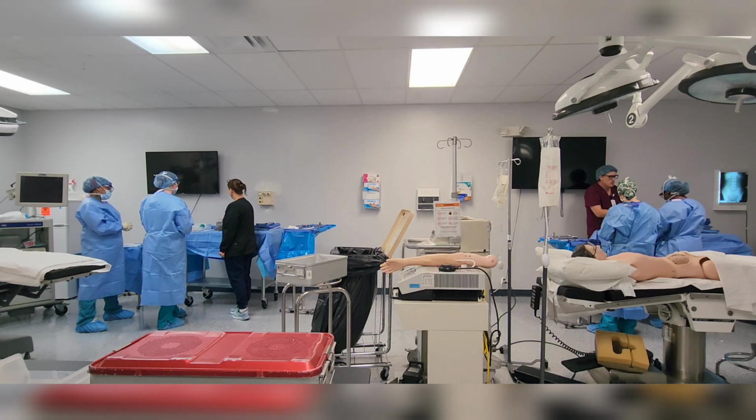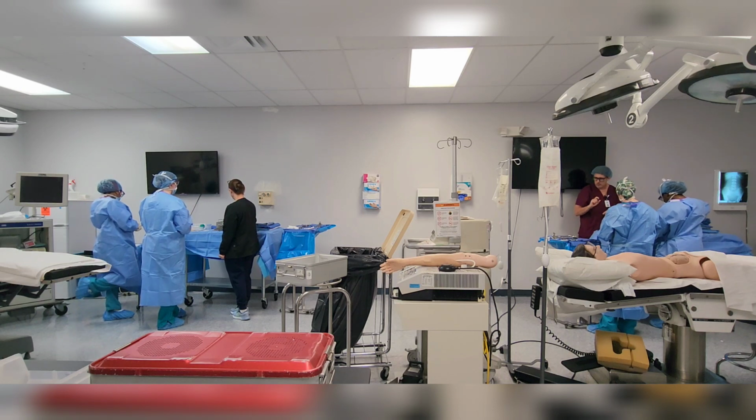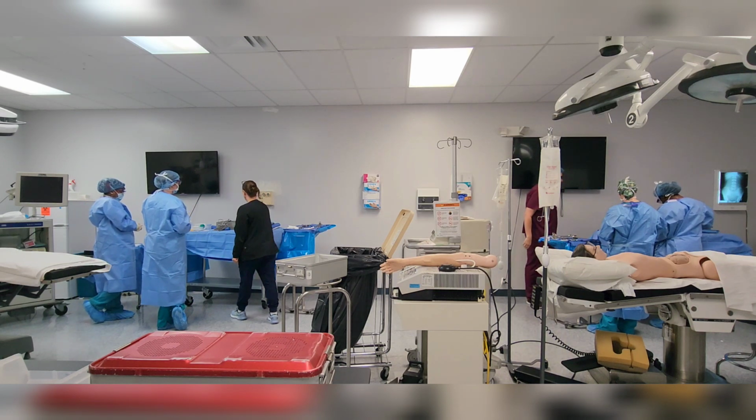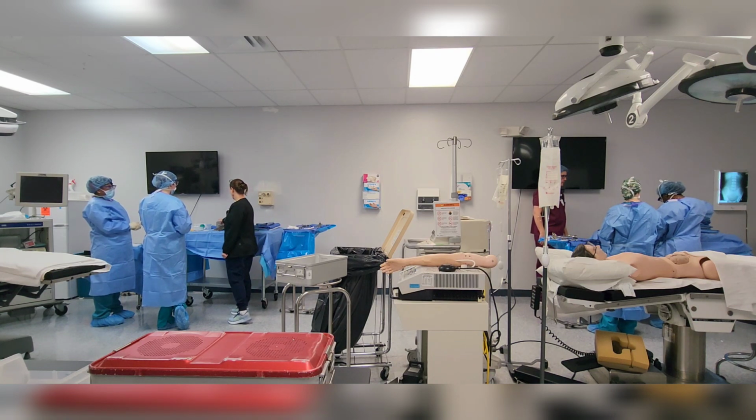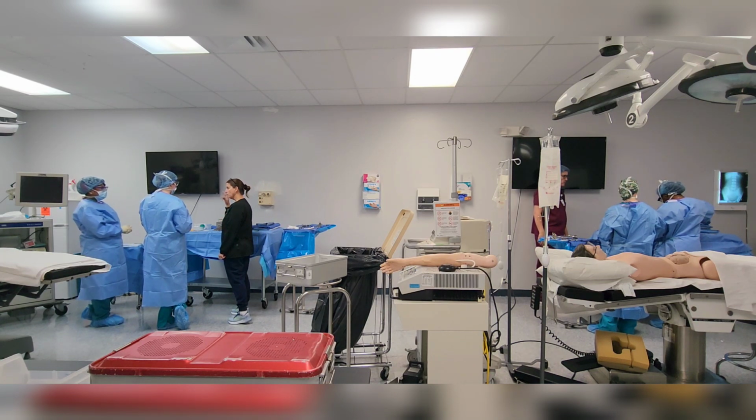So go ahead and do it. It always starts at that atraumatic graspers here. Have your needle. The needles are kind of designed to be right where it's supposed to go. What I usually do is just clip my right onto it. Anything with teeth on it should be considered traumatic, and unless the surgeon says otherwise, atraumatic it is.